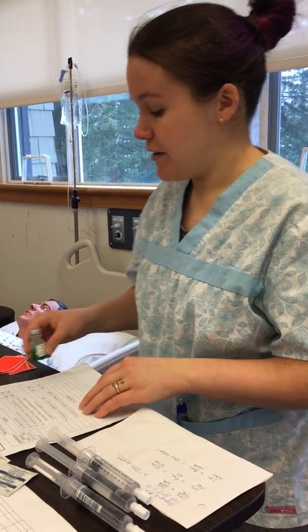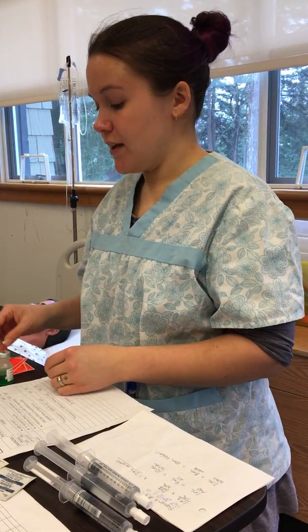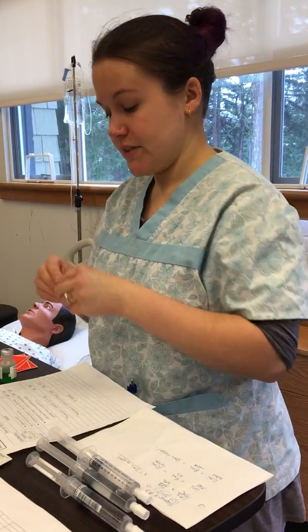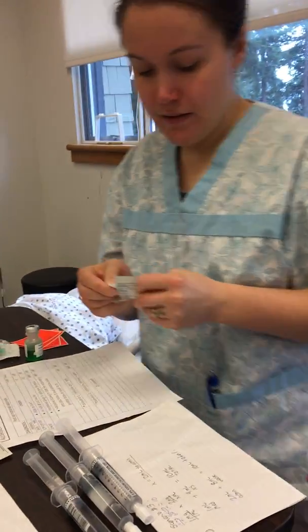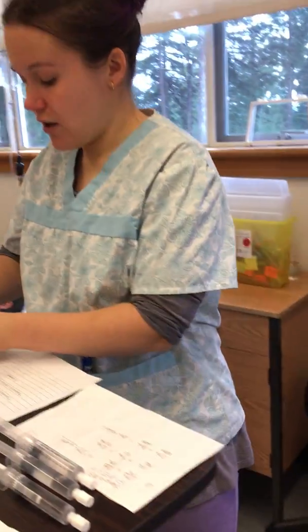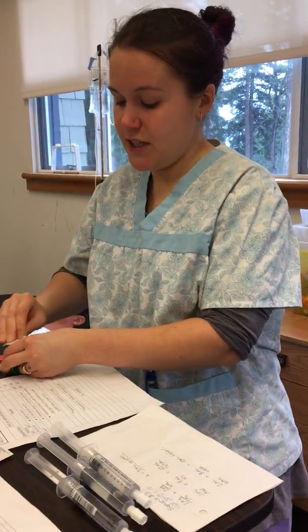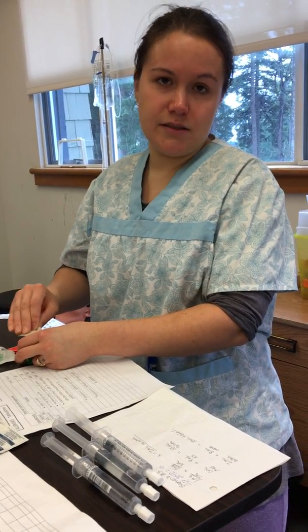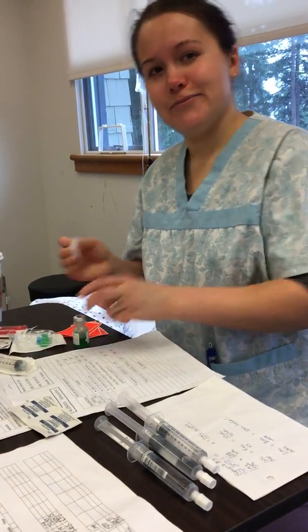Good. So now that I've done my checks, I can get the drug ready. So I'm going to clean the top of the vial for 15 seconds, which I wouldn't do for an ampule. I would just snap it and use a filter needle. So that's what you'd like to see me do, but I can't.